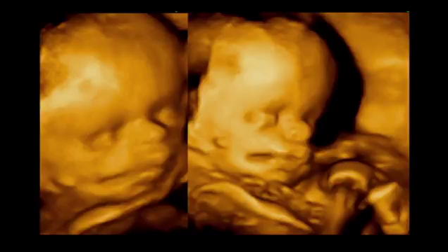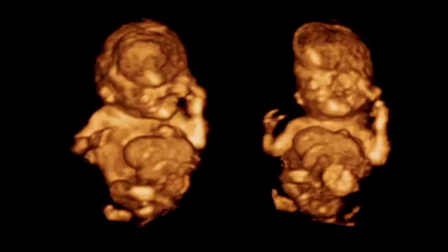Looking at this young fetus at about 12 weeks, you can see on the 3D that there are many, many abnormalities here. There is a cranial abnormality with the brain outside the head. You can see that there's a huge facial cleft here. Now, this facial cleft is right through the middle of the face.